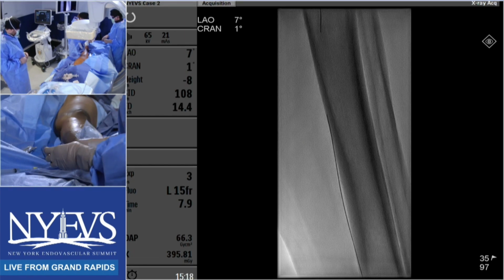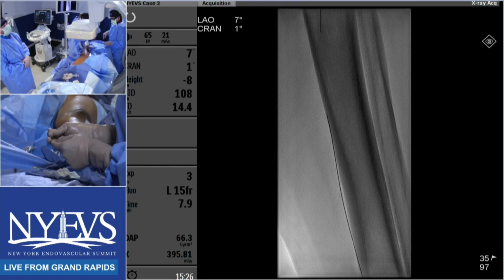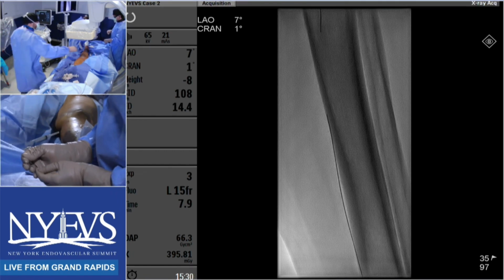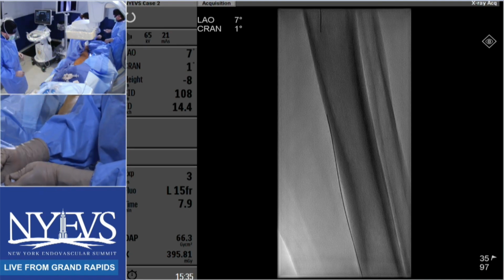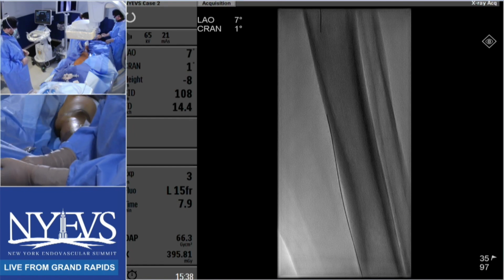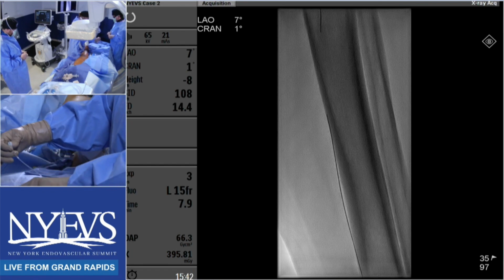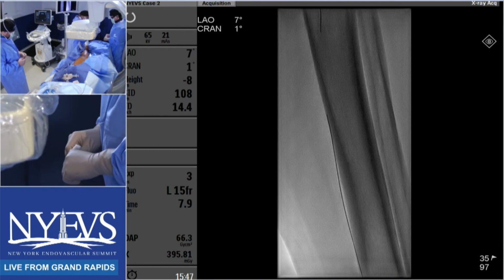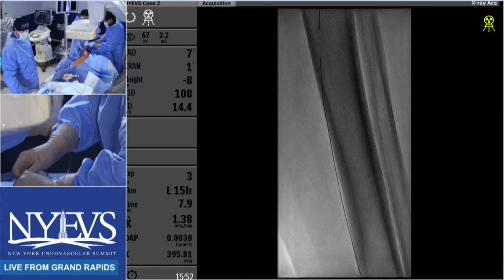Just a comment, Fadi Samsky, hope you're doing well. I think two things we went through quickly for the sake of time are the indication for atherectomy here on the ISR, and the failure to advance your IVUS catheter. In the current controversy of atherectomy, it's hard to debate the role of laser atherectomy in ISR. As you mentioned, it has randomized data behind it, and in my practice it's standard of care. So debulking that with laser is completely appropriate. Between that and the DCB, you can get pretty good results, at least in my practice.